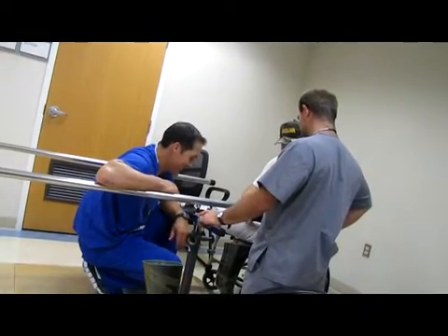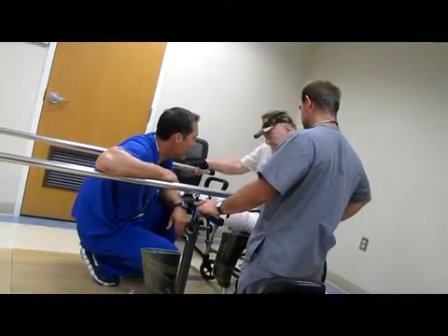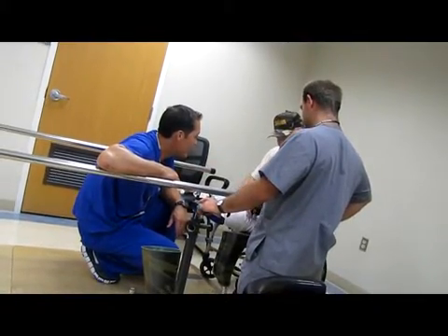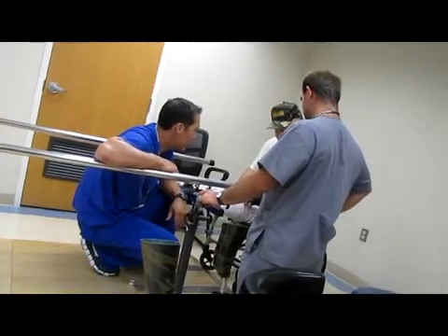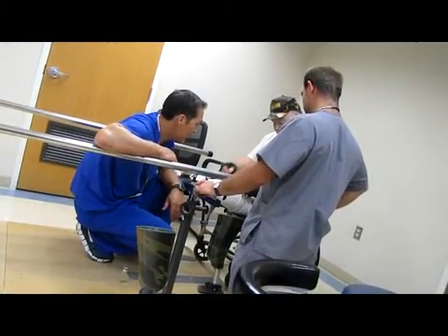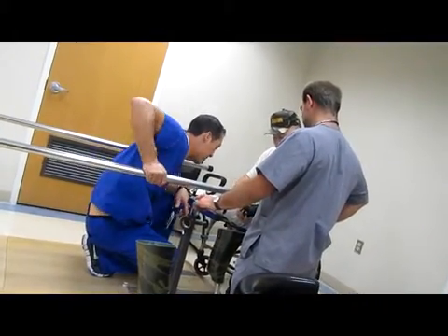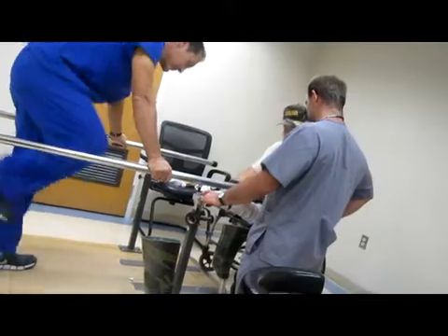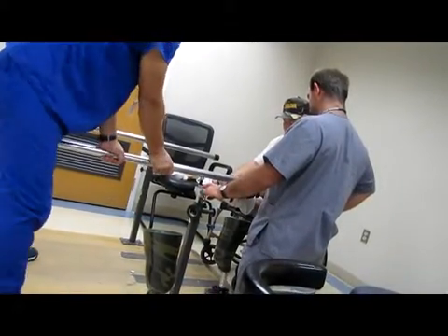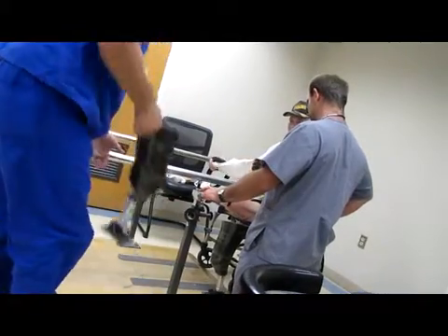So if it did come loose a little bit in the house, all I'd have to do is stop and push it down again. This might be a bit of a pain, the way it came off, for me and her helping me get it off. Well, maybe we'll try shrinkers on both legs. I'm always scared if it gets so tight on there that they have to jimmy around with it that it might start swelling up, and then it'd make it even worse.